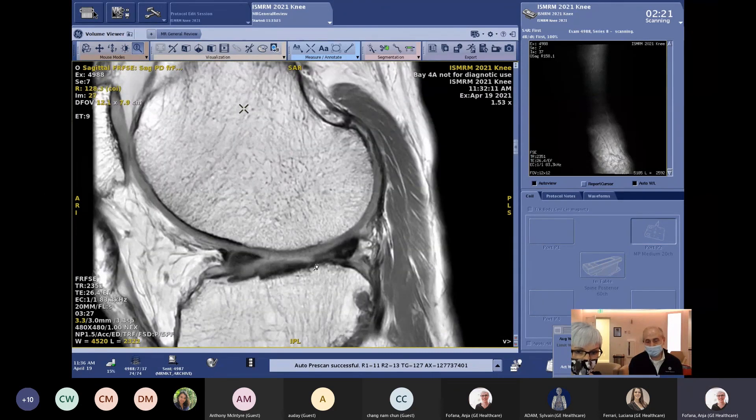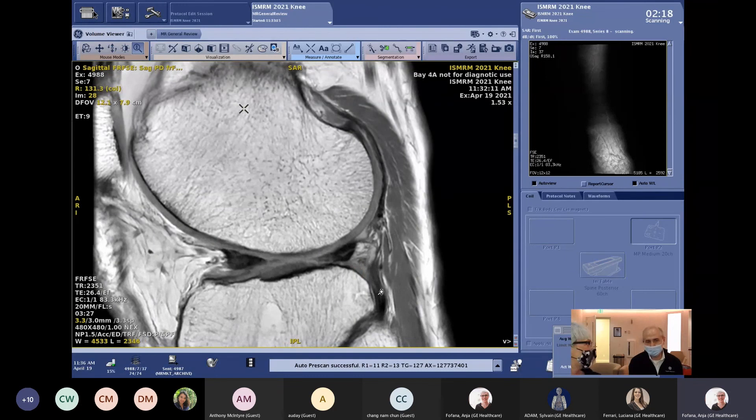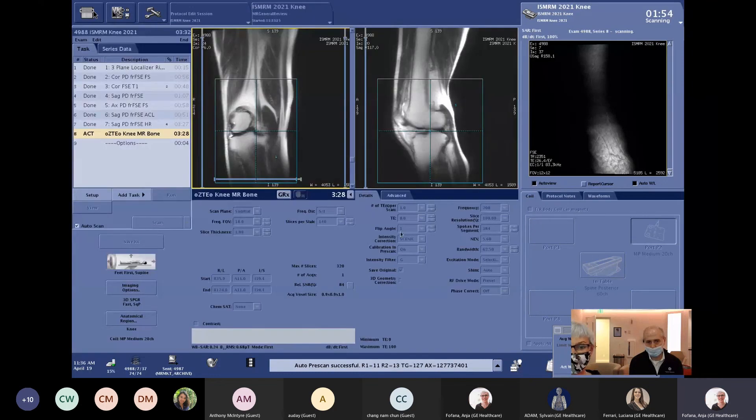You may have heard the scanner running in the background throughout the session, but right now you might not hear it — because the Osteo acquisition is a silent scan technology. We're actually scanning right now, about a minute into the acquisition, but we can't hear it running. The reason is zero TE — the gradients are not switching on and off the entire time; they stay on and read out continuously. That is why there's no noise in the background. Afterwards, you get nice bony structures with the advantage of no acoustic noise.